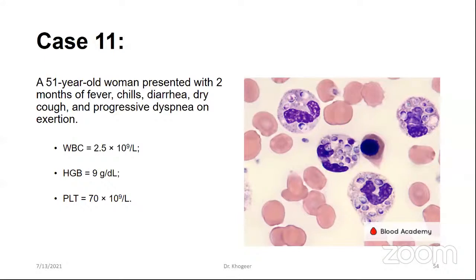Is there special care? Yes, we can see increased granulation in patients using GCSF. This is why I said increased granulation. Toxic changes is a terminology given to neutrophils that show increased granulation, either due to infection or drugs like GCSF.